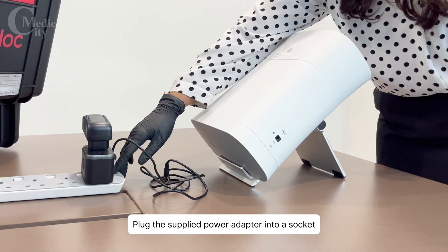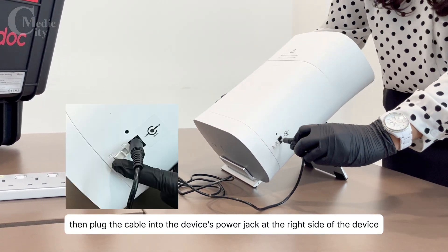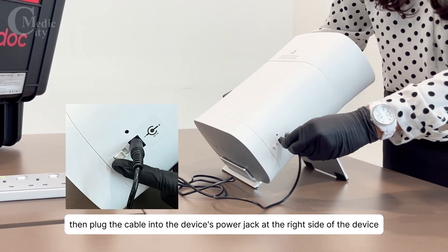Plug the supplied power adapter into a socket. Then, plug the cable into the device's power jack at the right side of the device.